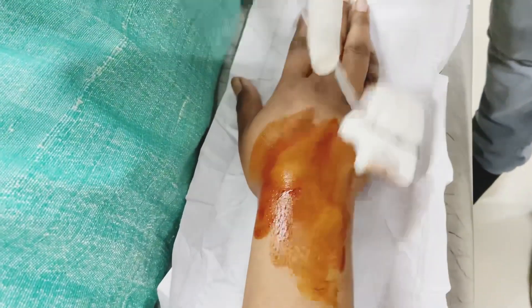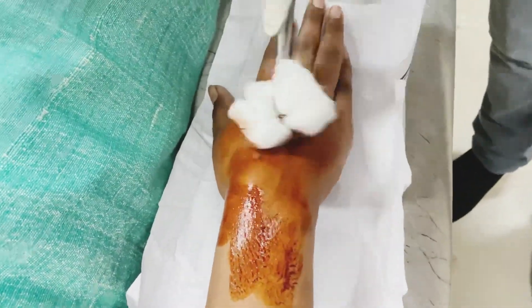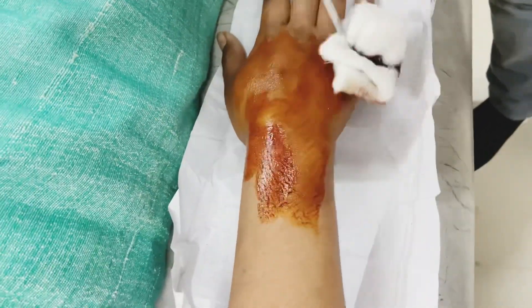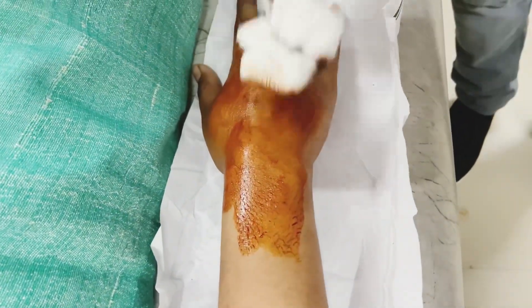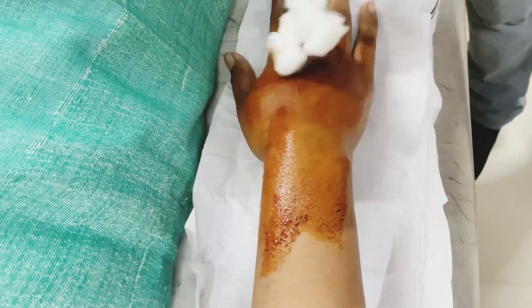Many modalities of treatment are available, but aspiration is usually the treatment of choice. Today I will show you how to do ganglion cyst aspiration.